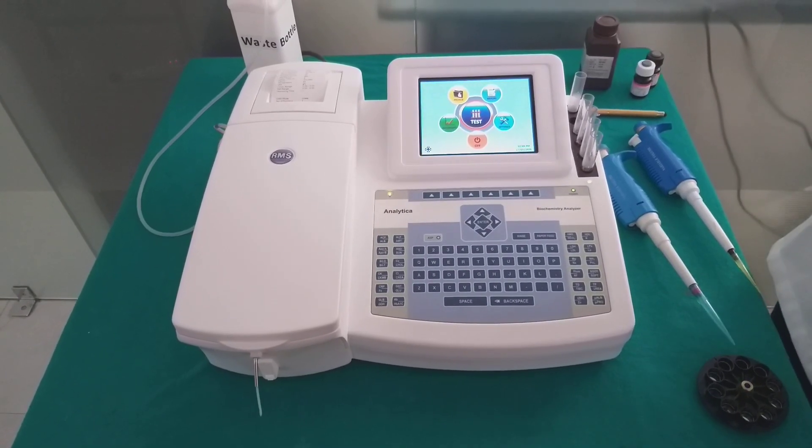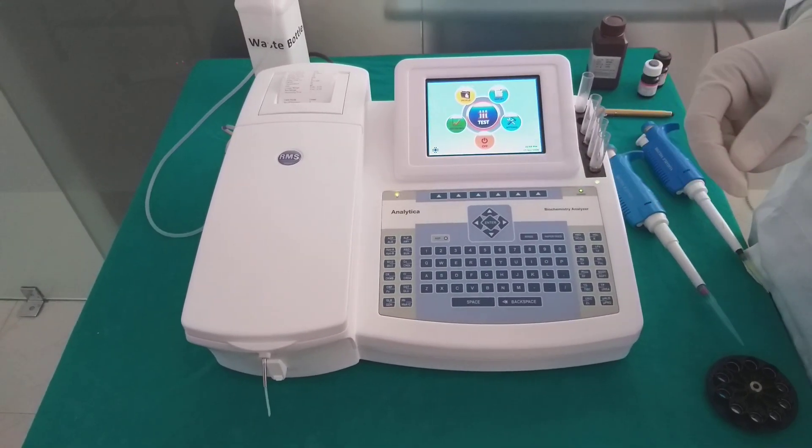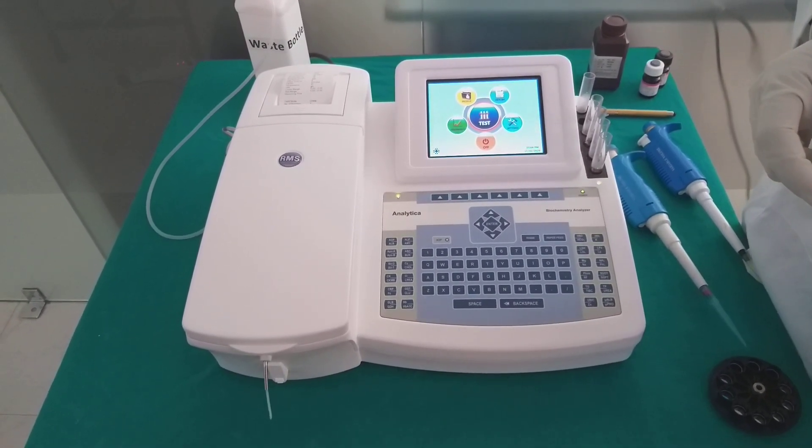Analytica has various series for various models. For more details about this biochemistry analyzer, please visit our website rmsindia.com.